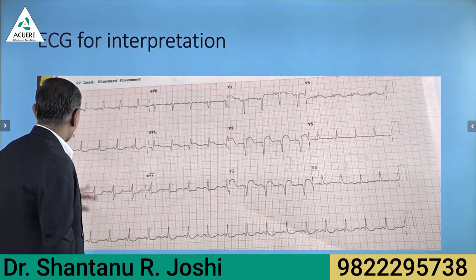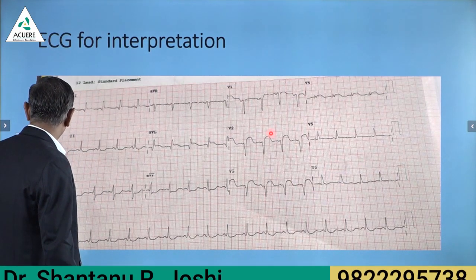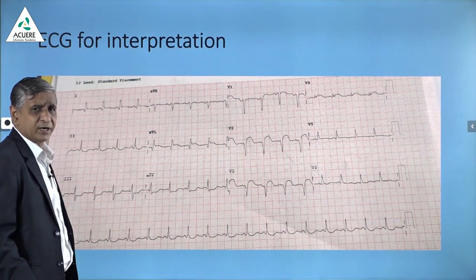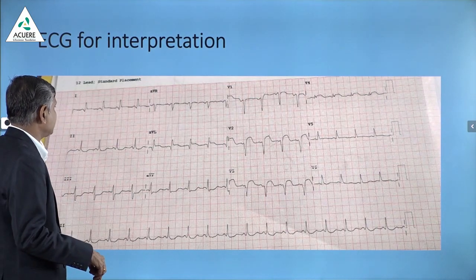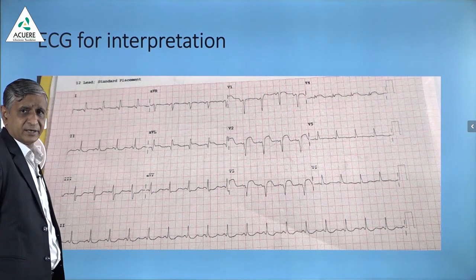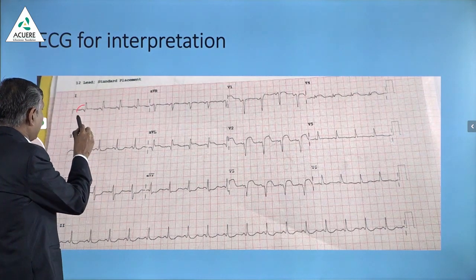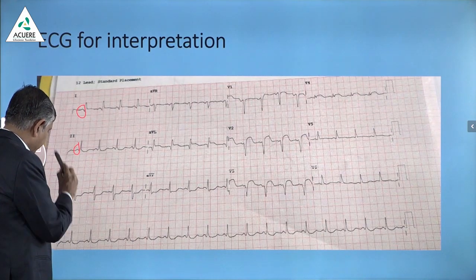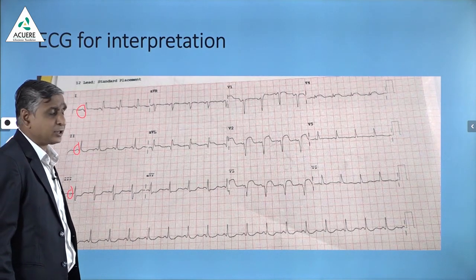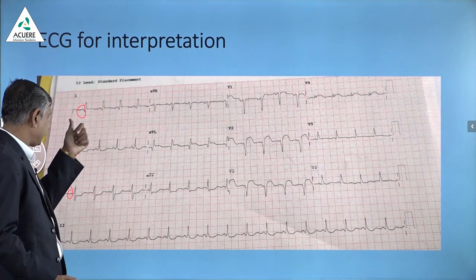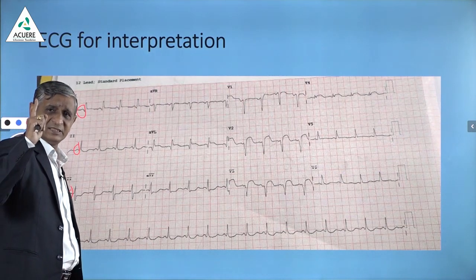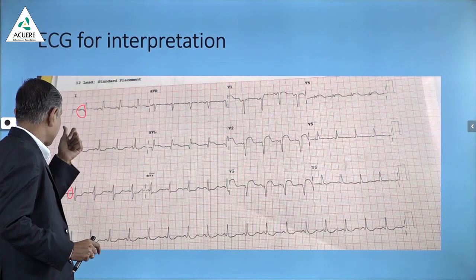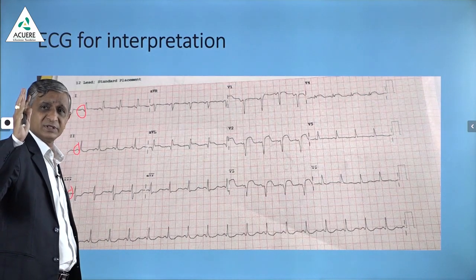Now I am going to comment on this ECG. But before making any major comment, every student should note that every time when you see an ECG, the first and important thing you should look at is the P wave. If you find the P wave and it seems to be normal, then you should say that the heart is beating in sinus rhythm. This is the first conclusion of this ECG — the heart is beating in sinus rhythm because P waves are normal.